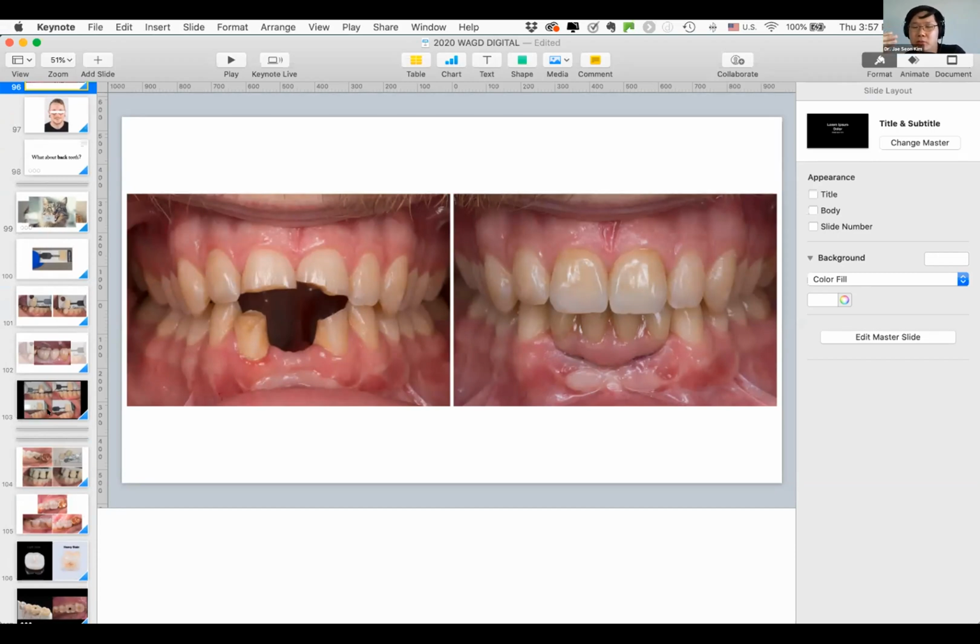Straight on with the centrals in the middle, and then turned, shooting perpendicular to the canine itself. You want 2 angles because the canine has 2 sides. The mesial part has to match the anterior section, and the distal portion has to match the premolar section.